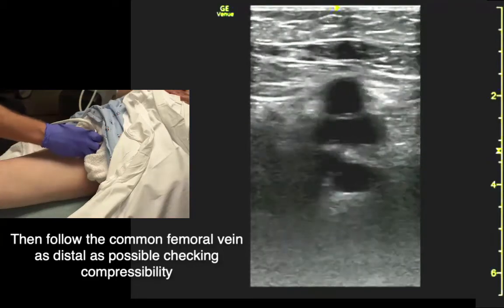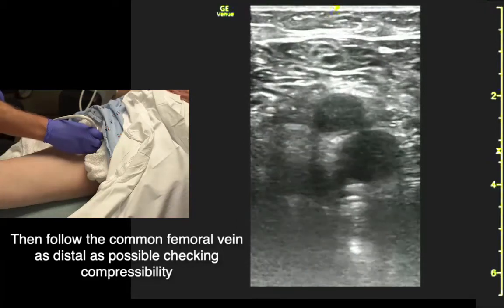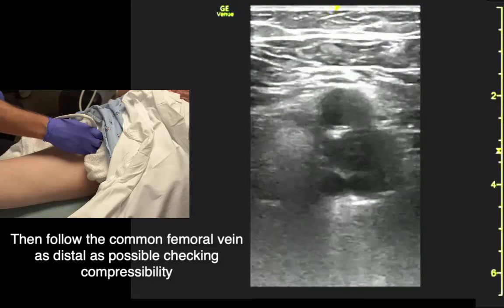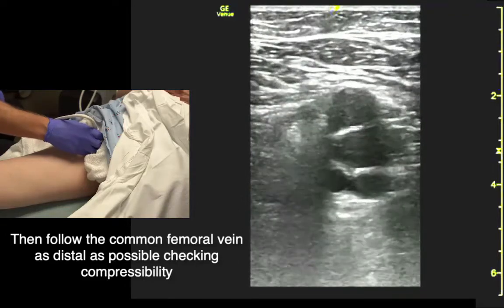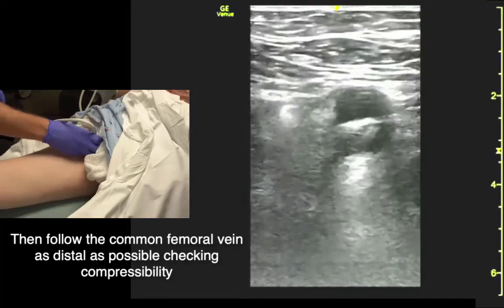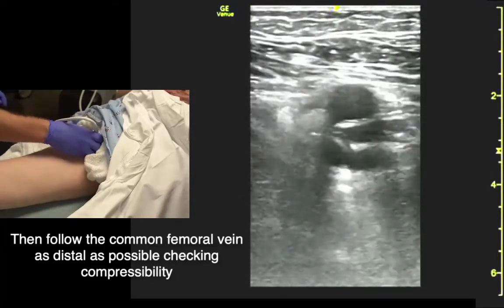You can see that deep one down there. There they split. So if you're doing a DVT study, you've got to get down to that point.